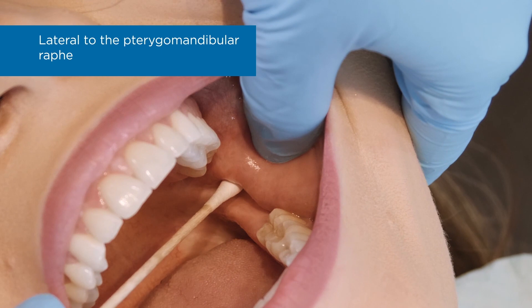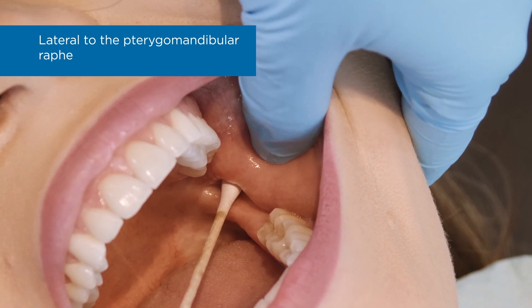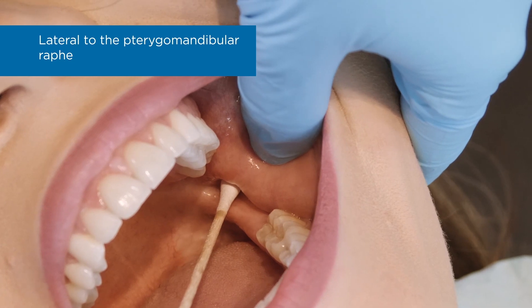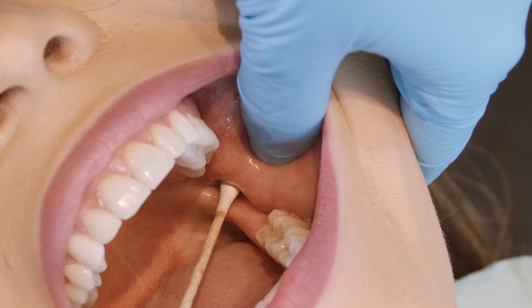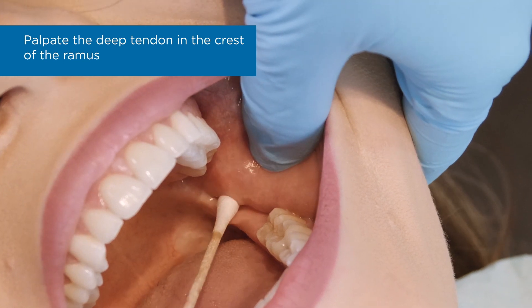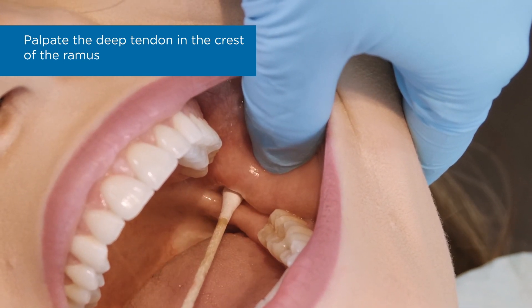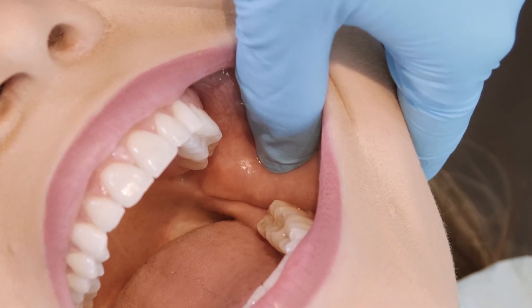A line bisecting the thumbnail establishes the height of injection. The insertion point itself is on this line, just lateral to the pterygomandibular raphe — the soft tissue roll that denotes the junction between the buccinator and superior constrictor muscles and marks the medial border of the pterygomandibular space. The lateral border of the space can be determined by palpating the deep tendon of the temporalis muscle on the temporal crest of the ramus. The insertion must be made medial to this landmark.